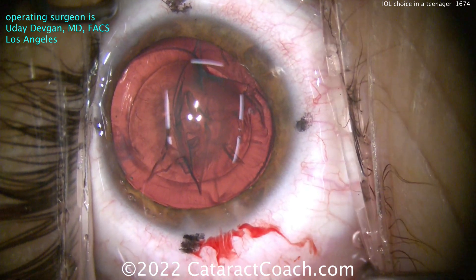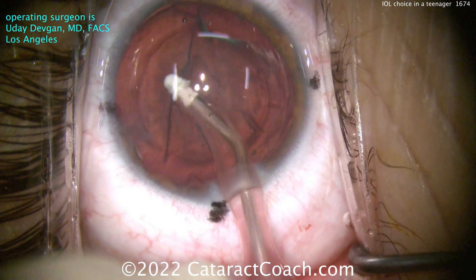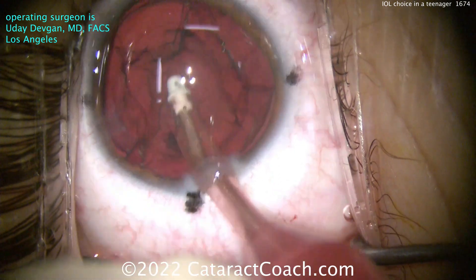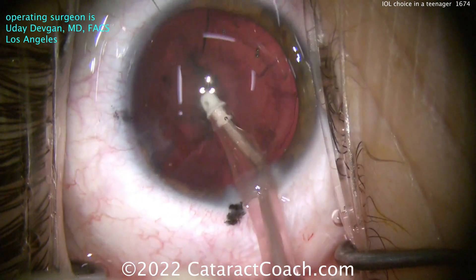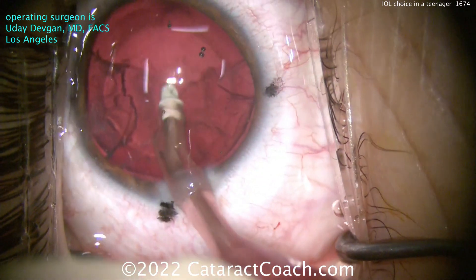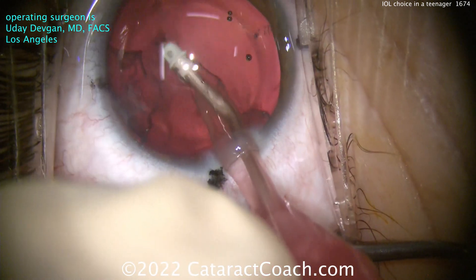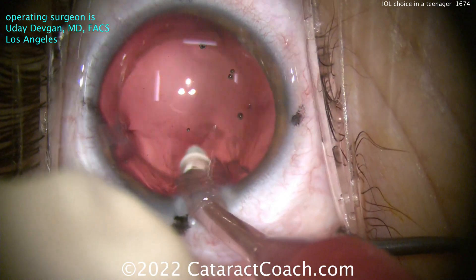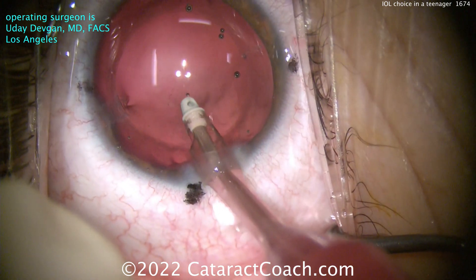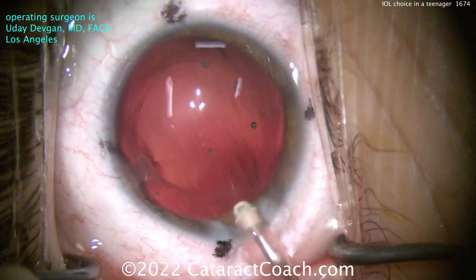I need to give this young patient a beautiful result without any issues. Notice the bleeding from the main incision — I love it. I definitely want to nick those limbal vessels because that means great long-term sealing and healing for this patient. I want great stability — this surgery has to last the patient's lifetime. Aspirating out all the lens, which comes out easily. Let's clean up the cortex and look carefully to make sure there's no posterior polar component. The capsule looks pretty strong. So what lens did I choose? It's coming up.